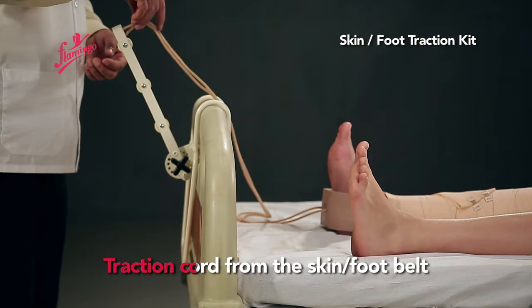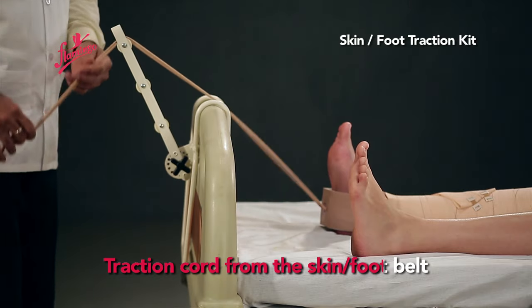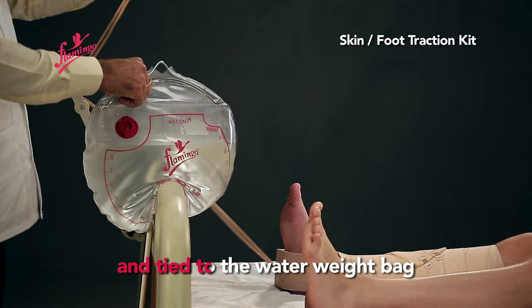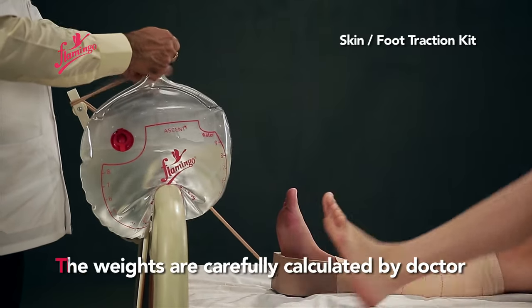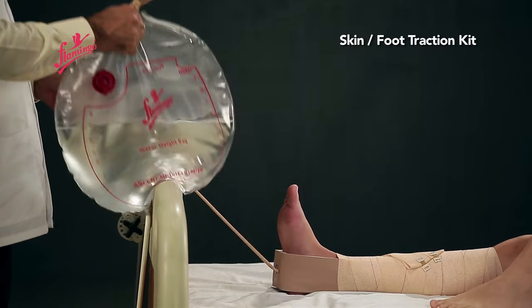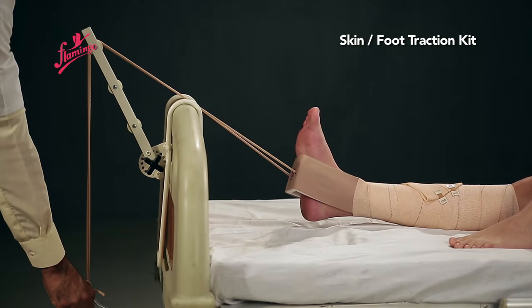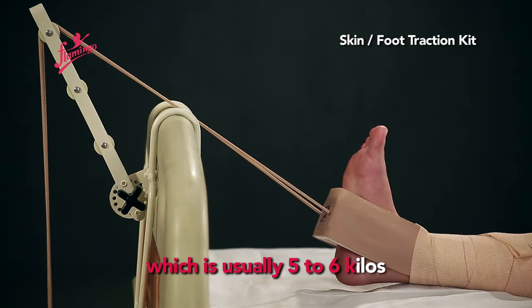The traction cord from the Skin Foot Belt is then passed through the Traction Pulley and tied to the Water Weight Bag. The weights are carefully calculated by the doctor considering the age, weight, and ailment of the patient, which is usually 5 to 6 kilos.